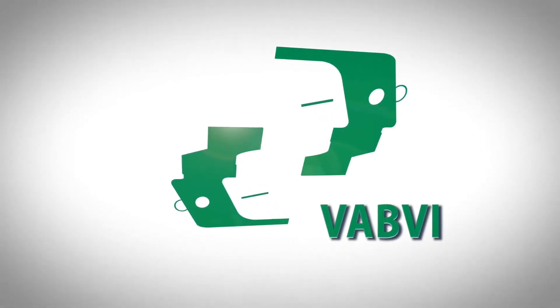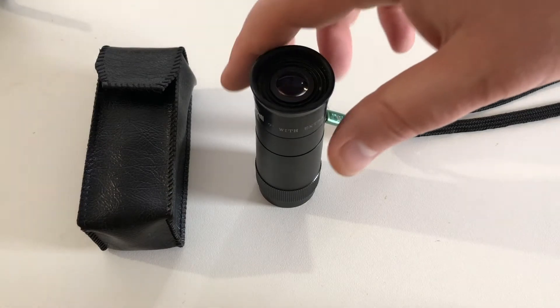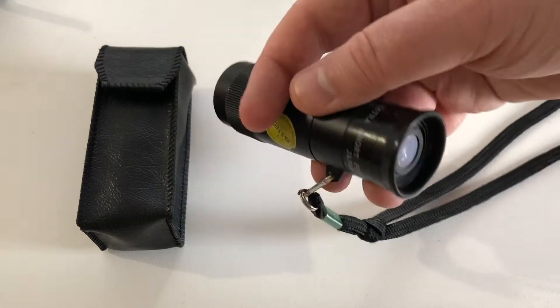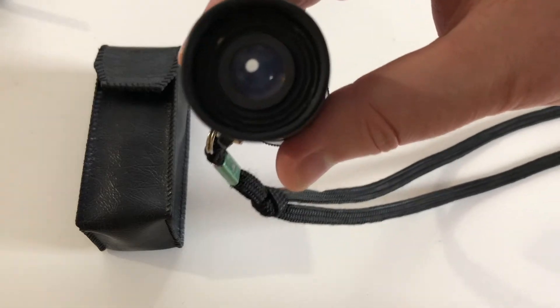The Vermont Association for the Blind and Visually Impaired. Today we're talking about monocular telescopes. Here we have an 8x monocular telescope. There's the aperture where the light comes through, and the other end with the eyepiece that has a rubber gasket around for comfort and to block out light.